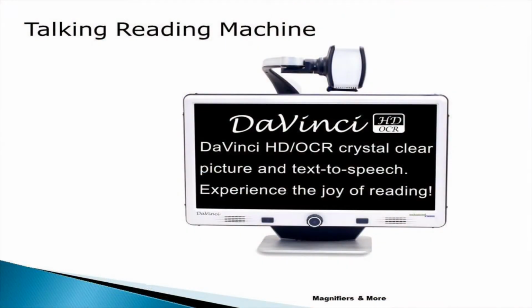This is called the Da Vinci. And I do not know why they named it Da Vinci, but Da Vinci is a CCTV. So if any of you are familiar with CCTVs, they're the big screens where you put paper underneath the camera or whatever you're looking at, and it's magnified onto the screen, and you can control the magnification.